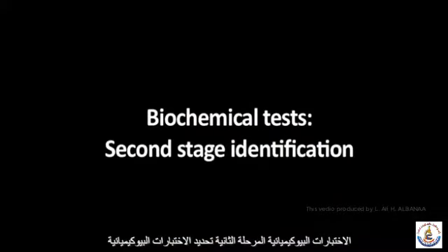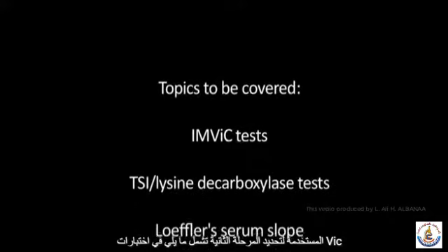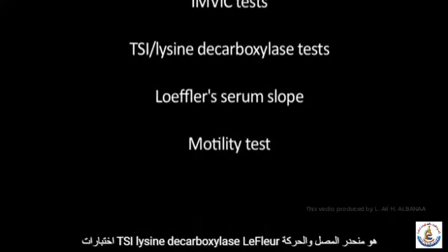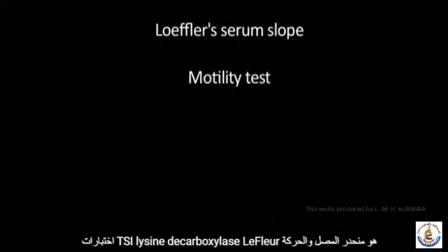Biochemical tests. Second stage identification. The biochemical tests used for second stage identification include the following: the IMVIC tests, the TSI and lysine decarboxylase tests, Loeffler's serum slope, and the motility test.